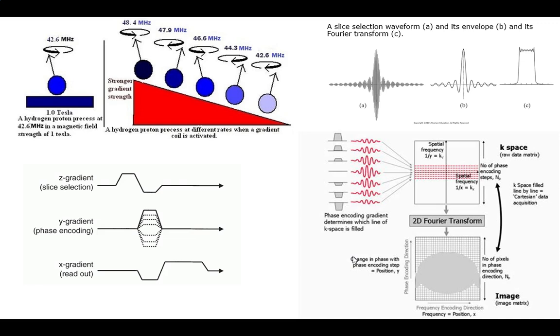So some of them will dephase faster than others will, which allows you to then read them out, right, based on your output reads. And that's all on the TE, the echoes, and the repeat, the TRs, which we'll get into what those will set for you. But essentially with this phase shift, I can set how fast different regions will phase, dephase, and therefore how fast I can read them out, which will give me a particular height differential, because this is all being done only in the Y direction. And then we change the readout.